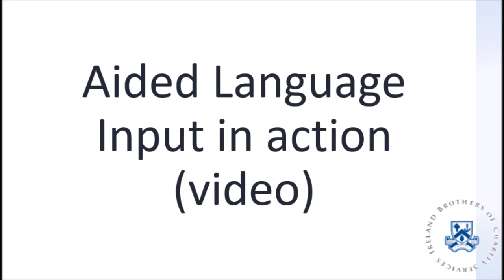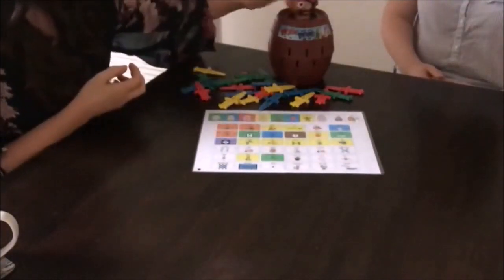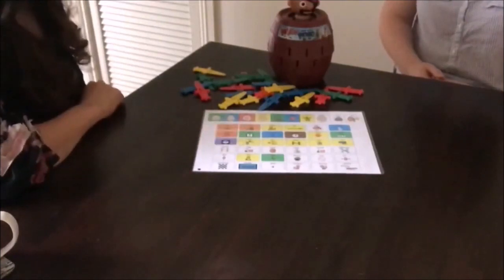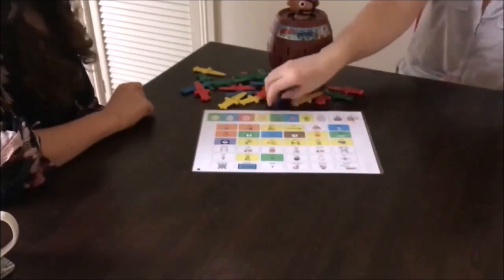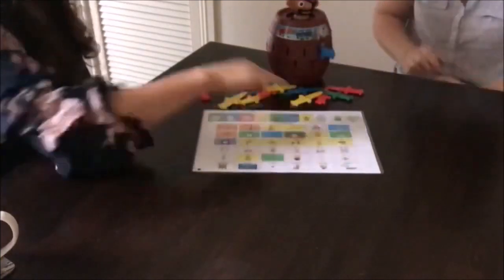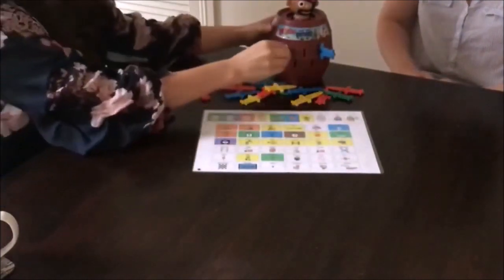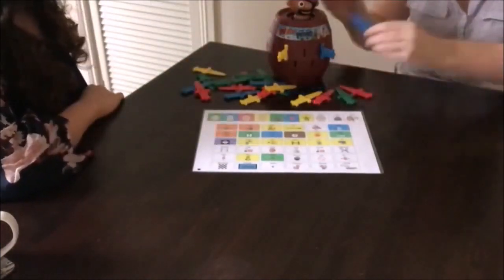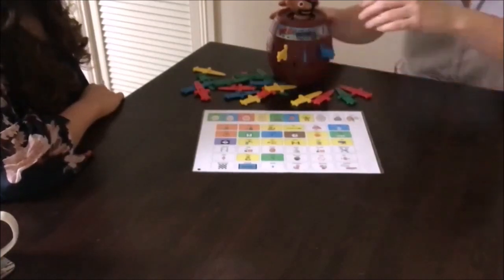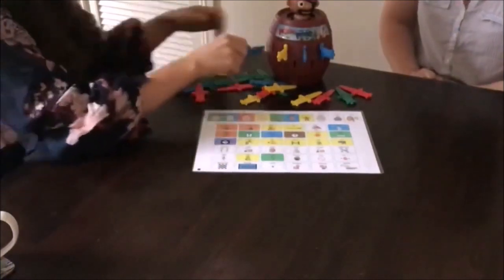So now we're going to watch a video showing aided language input in action. First, let's get the pirate. Who is going to go first? Okay, you go first. Good job. So we have to put the swords in. Excellent, well done. I'm going to take a turn. It's your turn. I'm going to do the same color as you. I'm going to do a blue as well.